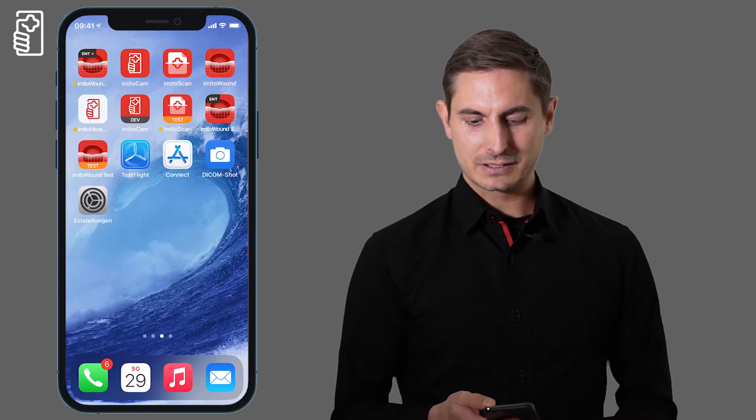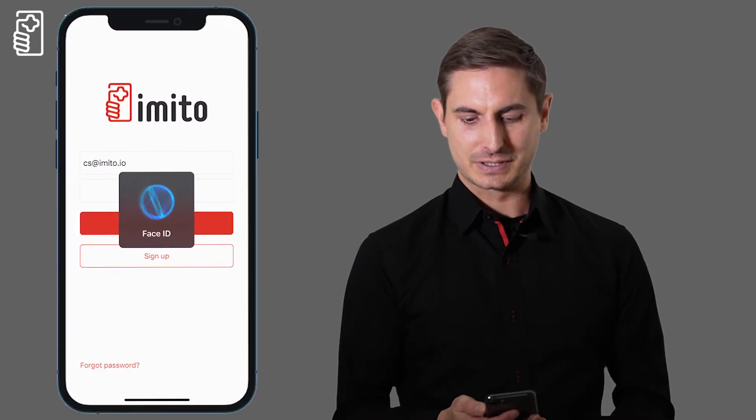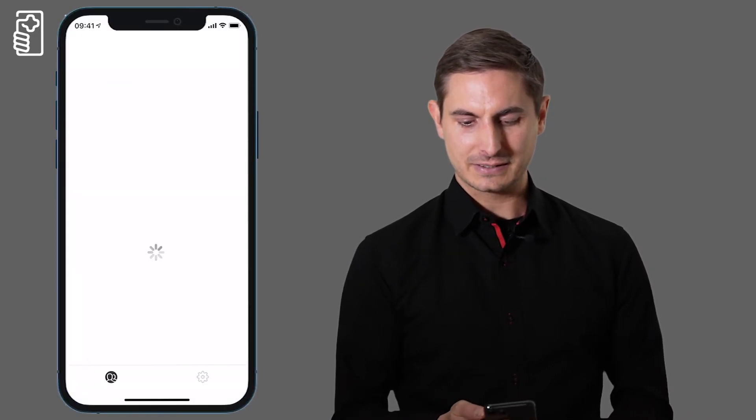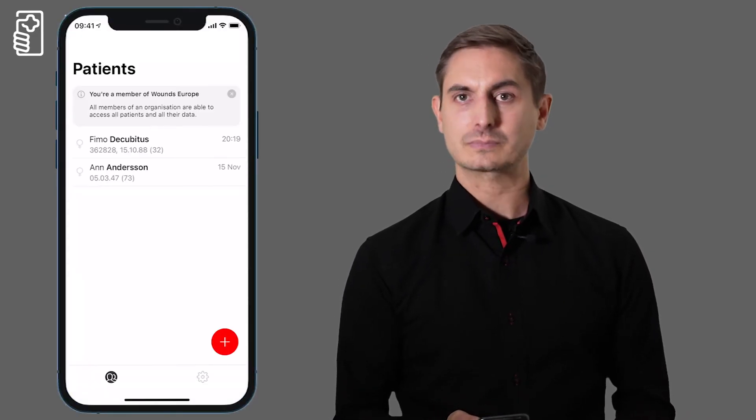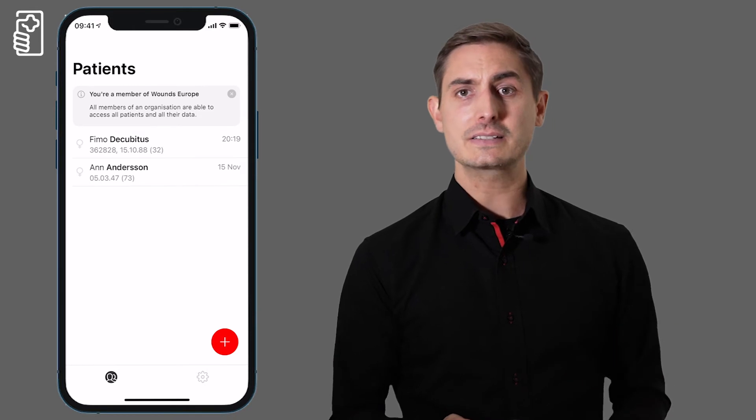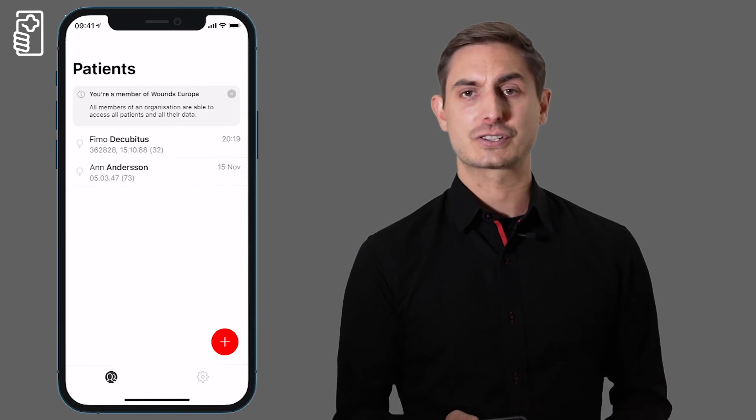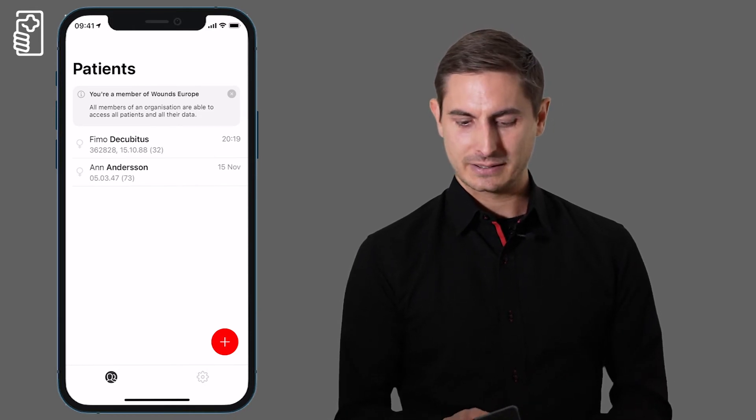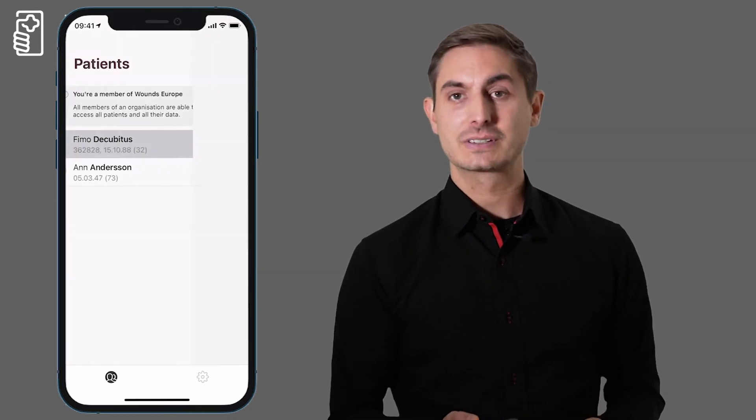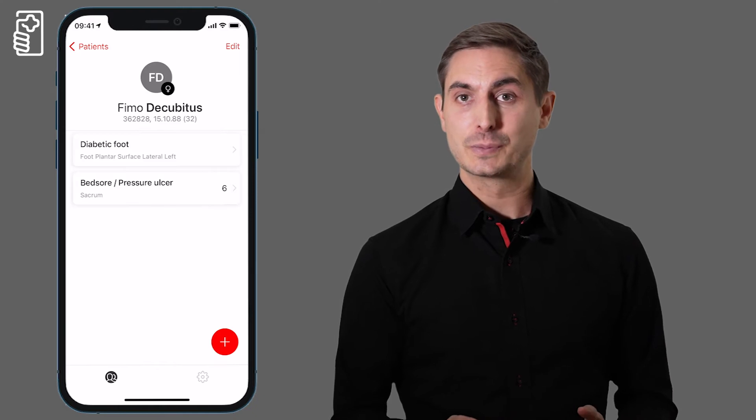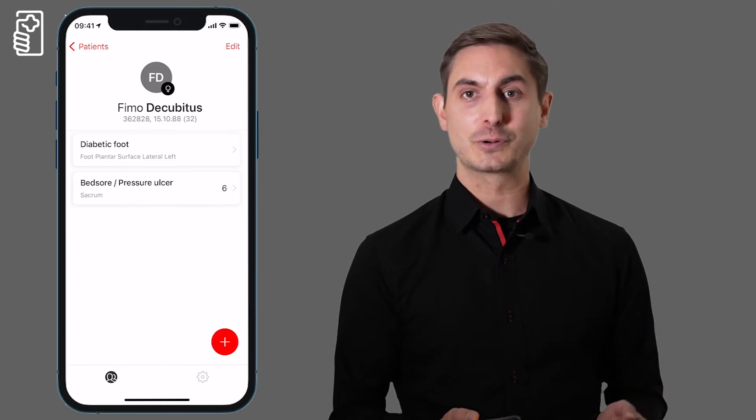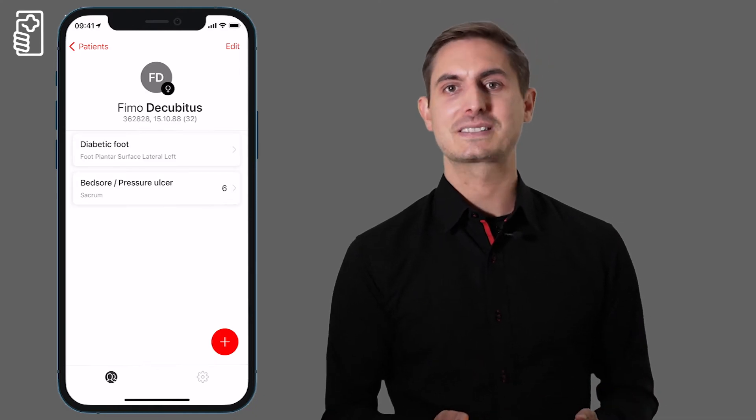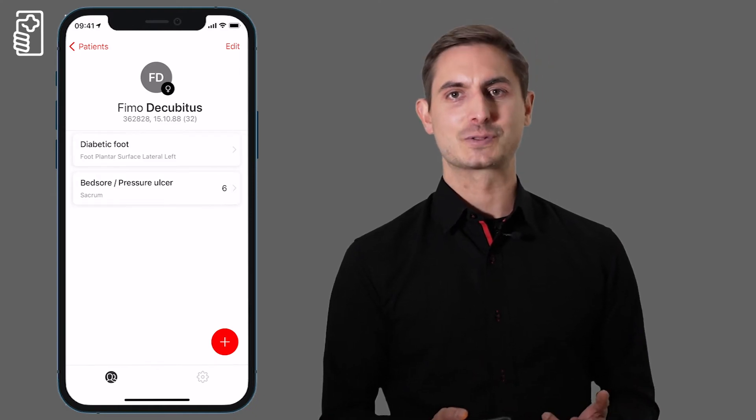Let me show you how it works. I unlock the app using FaceID. I get a list of all my patients and when I select the patient female decubitus, I get an overview of all existing wounds.